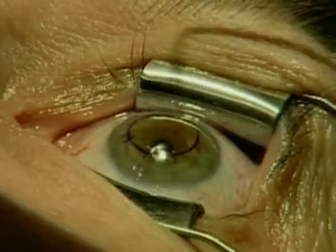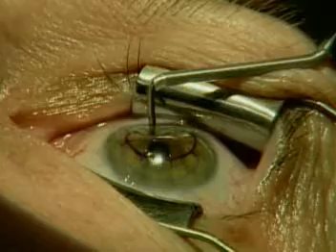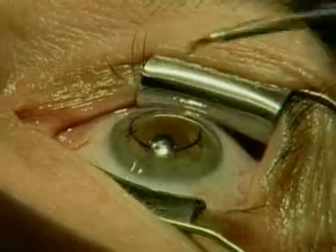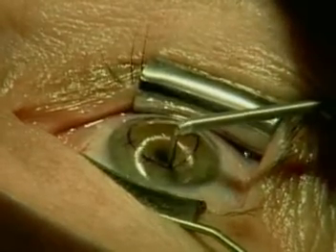You can see that we first start at the 12 o'clock spot, proceed then to the 6 o'clock spot, and then the 3 and 9 o'clock spots. Thereafter, we like to begin at the seven millimeter zone, followed by the six millimeter zone.